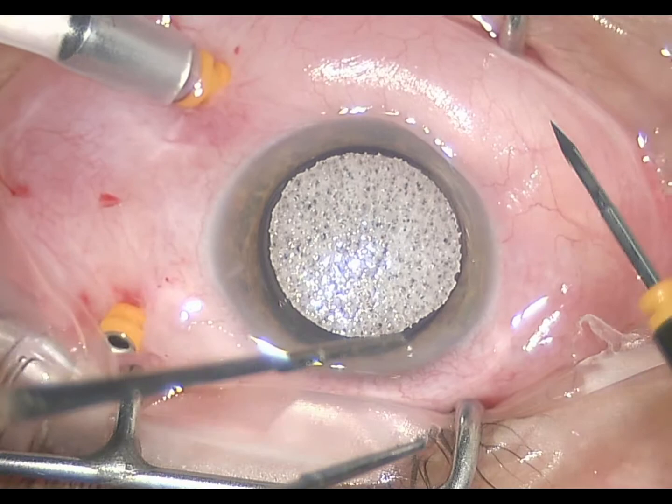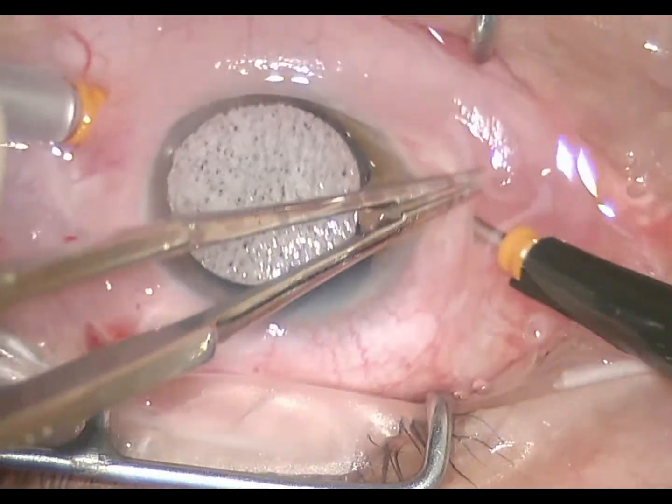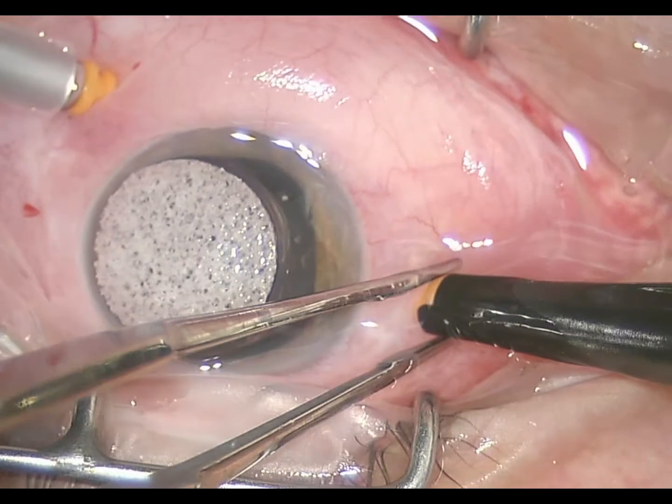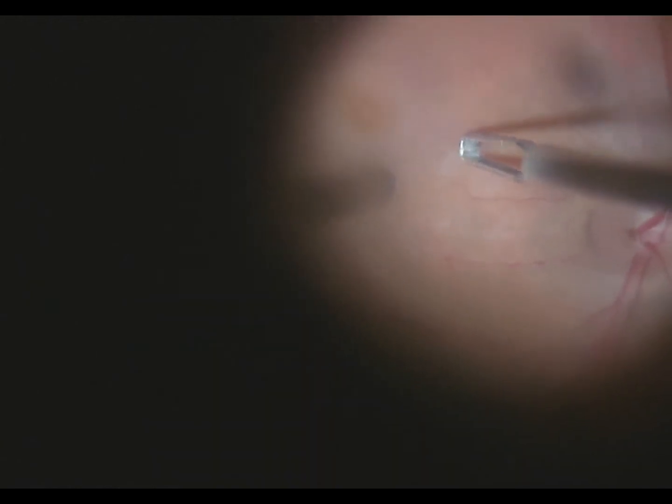This patient had a previous vitrectomy for a macular hole, but the macular hole did not close. So this surgery will show a limited vitrectomy. Here you see the peripheral vitreous being trimmed, and then the following step is the internal limiting membrane peel.